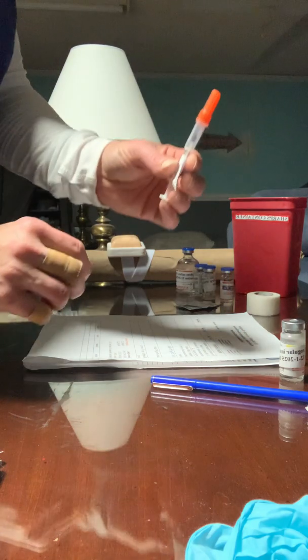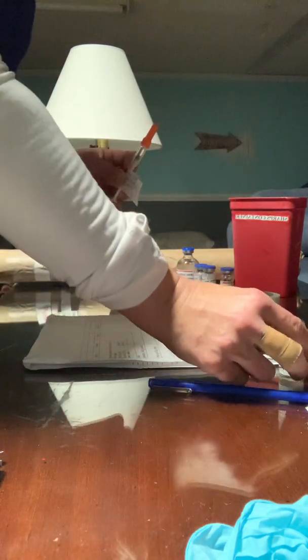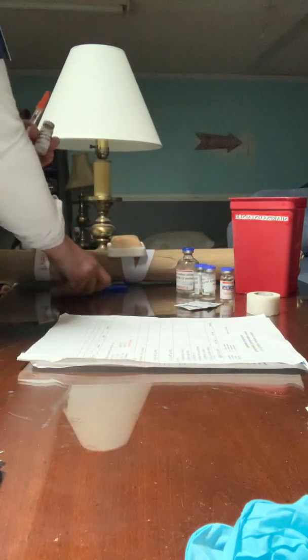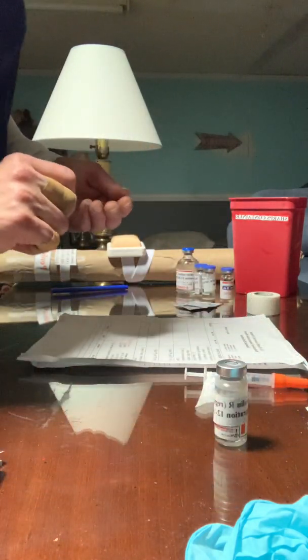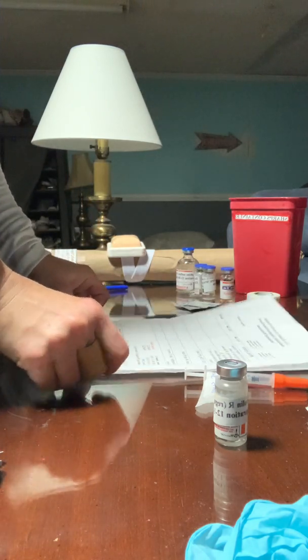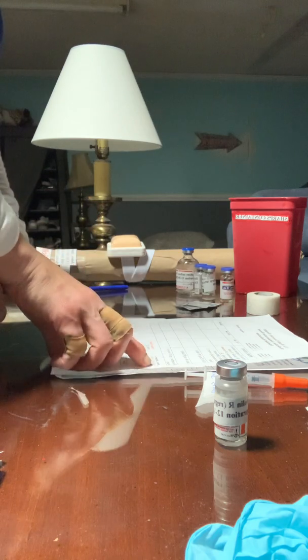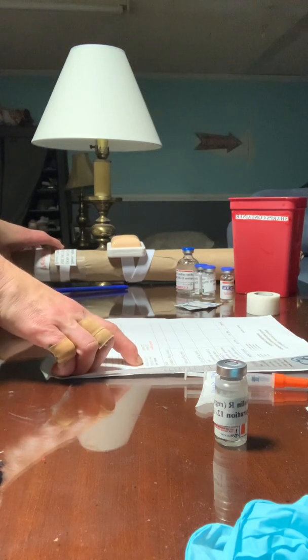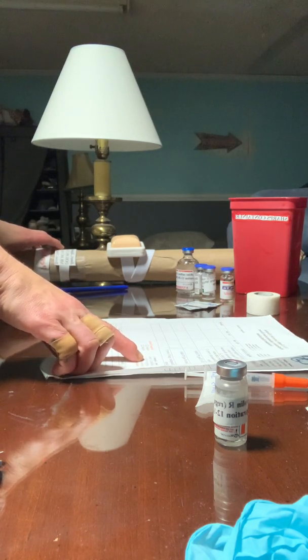Next, I will take Mr. Jones' syringe, the vial of medication, and the medical record number, and I will proceed to Mr. Jones' room. Once in the room, I will perform hand hygiene. Next, I will verify I have the correct patient. I have Jaguar J. Jones, medical record number 417-6352.